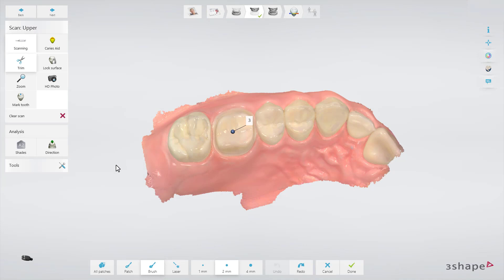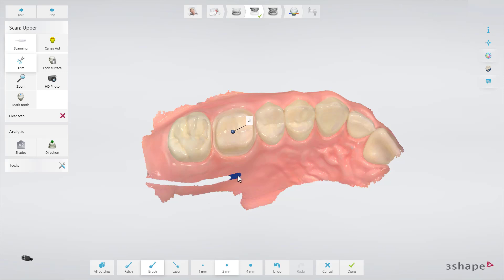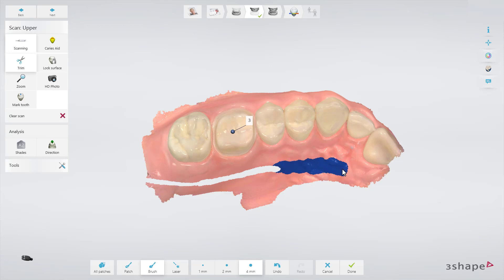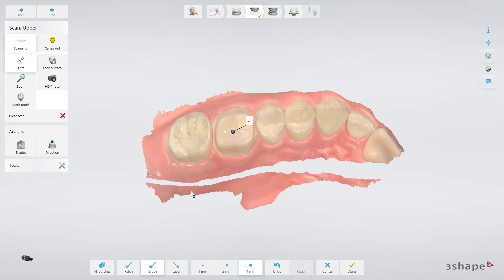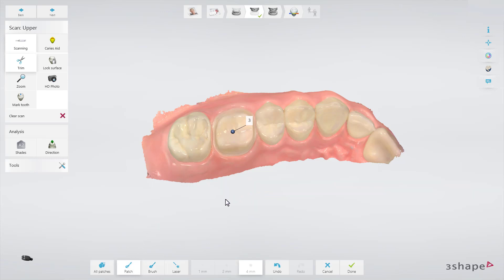In general, Trim provides tools for cleaning and trimming the scan. You can use Brush with different thickness options — 1mm, 2mm, 4mm — which removes the drawn, coloured part of the scan. Patch removes a free-hanging island by clicking on it. Or Laser, which cuts all the way through the model.